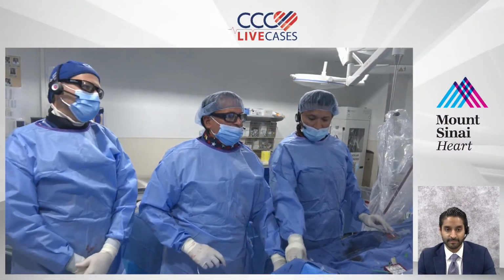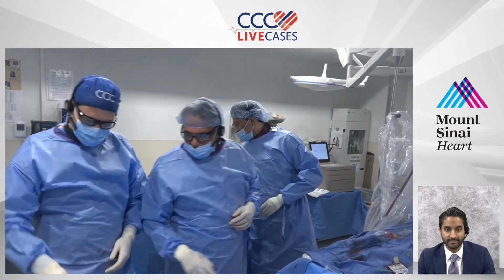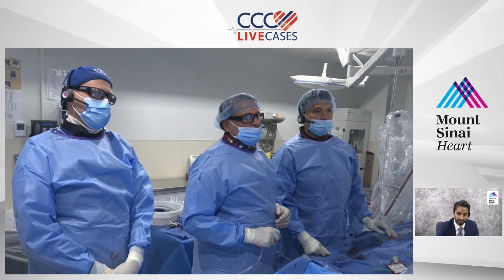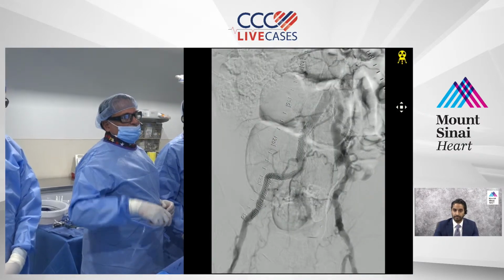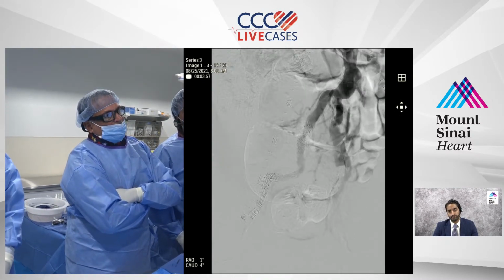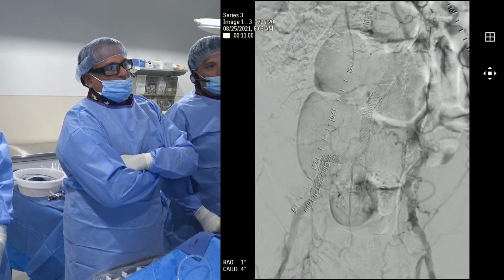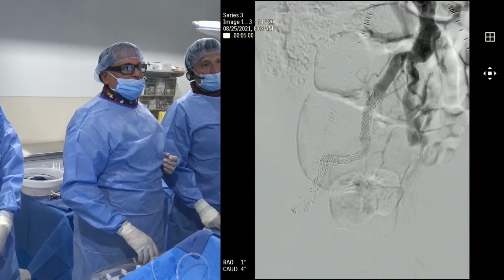All right, Raman, great job, and welcome to our team. I know that you were out in the last live case, so we welcome you to this really interesting live case. We have a case of a very complex aortoiliac bifurcation with a very calcified lesion, which is at a very high angle. So the issue is, how are we going to deal with this?